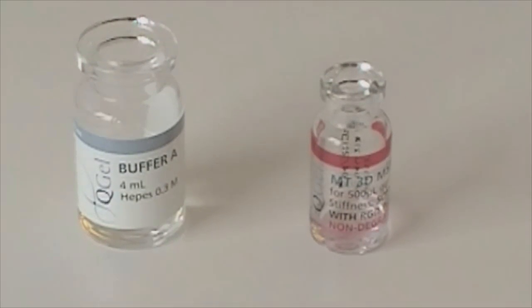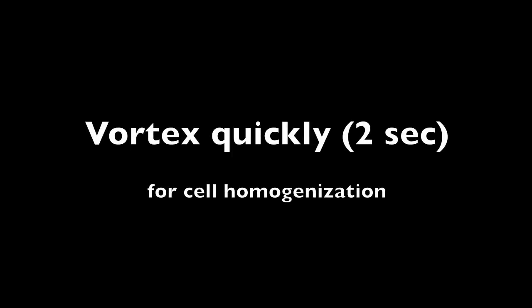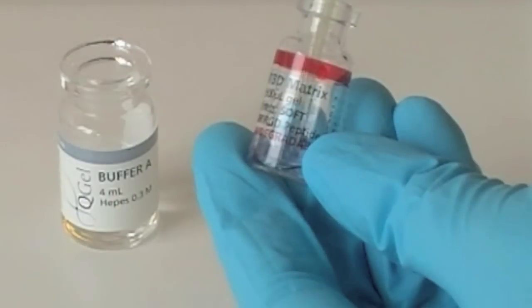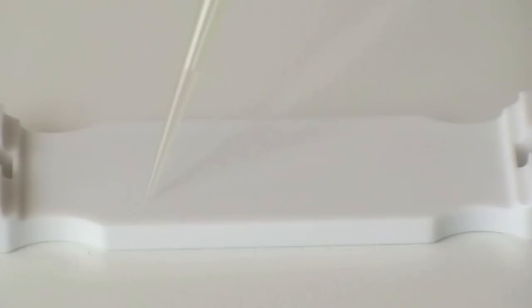Vortex again gently for about 2 seconds. Pipette the solution out and quickly apply drops on the caster. Drops can be 30 to 60 microliters in volume depending on the size of the disc that you want.